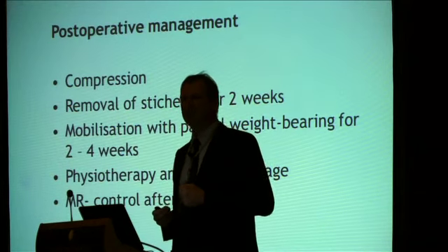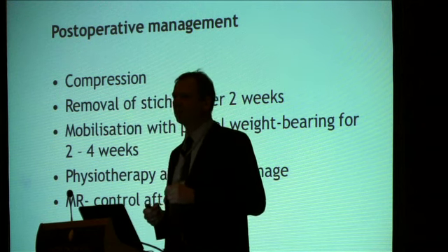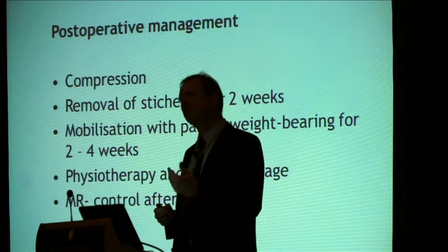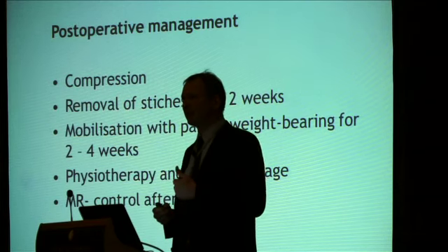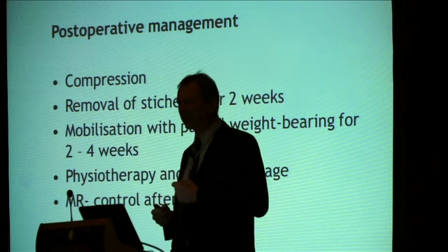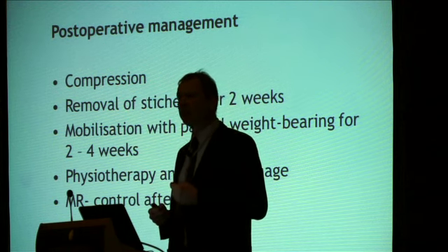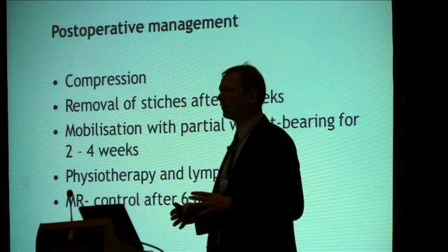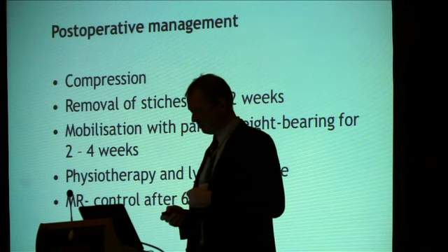What do we have to consider in the postoperative management? It's very important to perform good compression after such an operation. Because if we remove the synovia from the capsule, we always have a risk of bleeding, because this inflamed synovia is very well perfused. So that's why we always need very good compression in all joints that we treat by arthroscopy or even with an open approach.